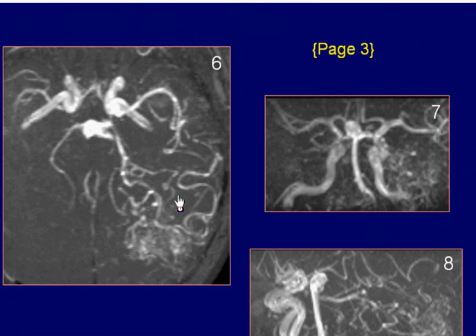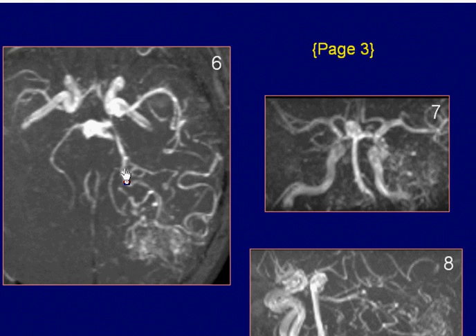MR angiogram shows abnormal dilatation of the tip of the basilar artery and a vascular lesion in the left occipital-parietal region. The arterial supply of the lesion is from branches of the left posterior and middle cerebral arteries. MR findings are consistent with AV malformation and basilar tip aneurysm.